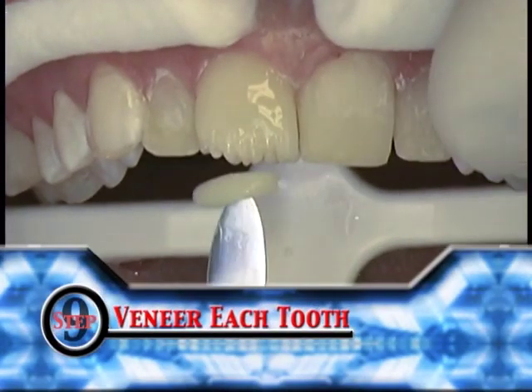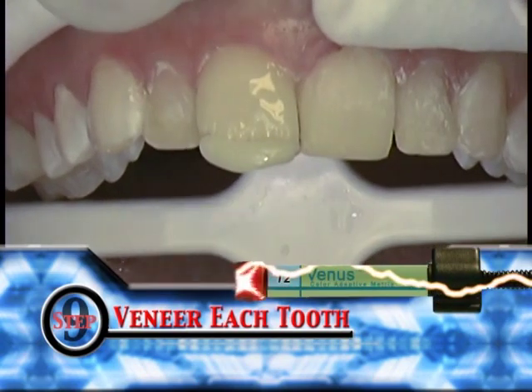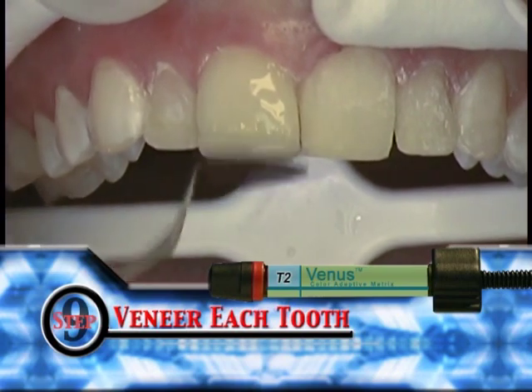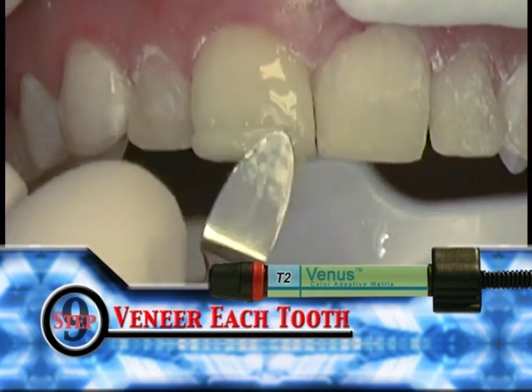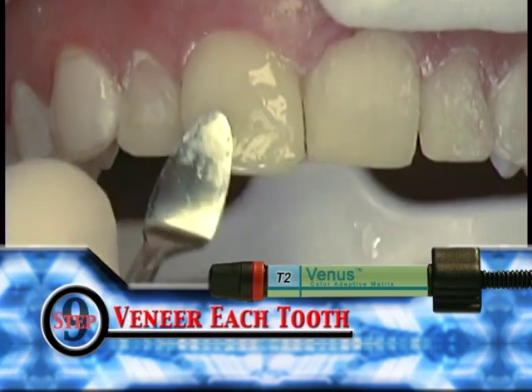To finish the incisal edge, take a small amount of the clear incisal Venus. In this case, we are using Venus shade T2, a neutral translucent color. Roll the material between your fingers into a hot dog shape and place it on the incisal edge to fill in the serrated edge. It's important that this step does not add any length to the tooth other than simply smoothing out the edge.